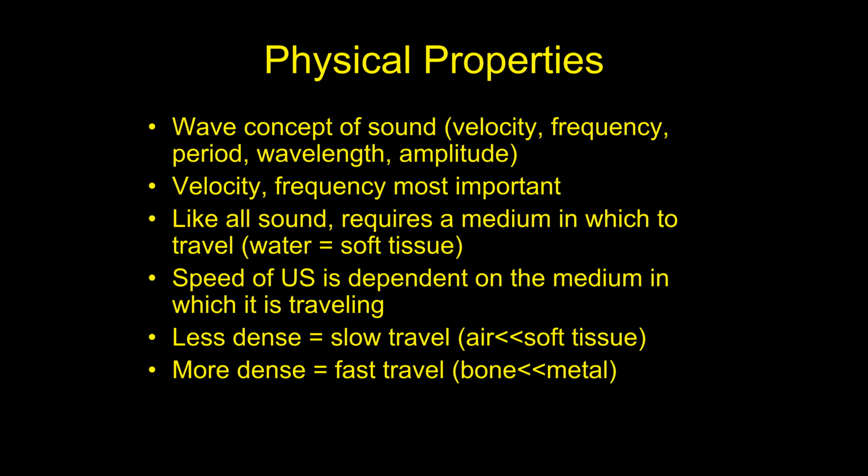So anything that's not very dense at all, like air, the sound travels slowly. The more dense or stiff a substance is, the sound tends to travel faster. So if I'm standing on one side of the Grand Canyon and I have a steel pipe, let's say, and I hit that steel pipe with a hammer, it's going to take a few seconds for that sound through the air to propagate to the other side of the Grand Canyon before you would hear it.